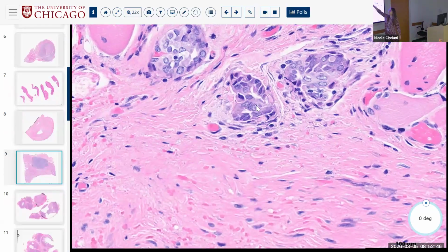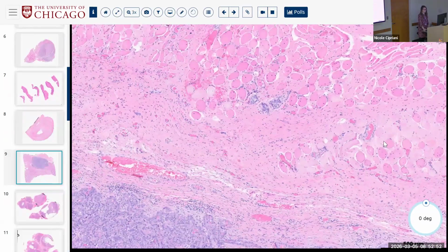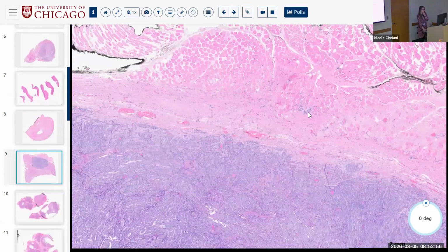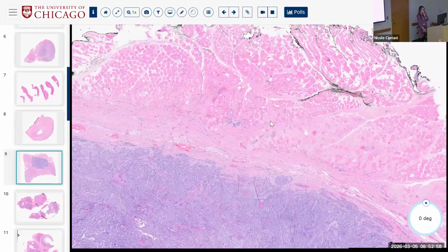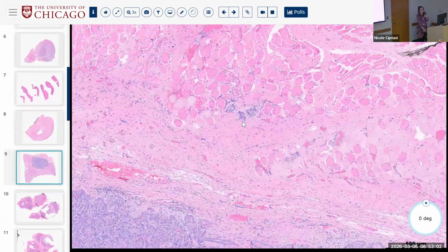So if you ever need help knowing whether these crinkly things in the skeletal muscle are tumor or, you know, vessels, for example, do the BRAF. This will help you if it's BRAF positive, right? Or you can do something like PAX8, TTF1, right?